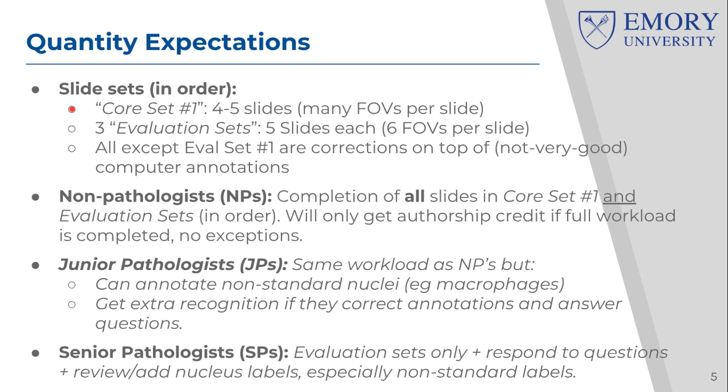The people who were with us in the previous iteration of this project know that the core set is annotated in a kind of collaborative fashion. So for the core set, you make annotations, you share your questions with the senior pathologist in the group, or other people in the group. They answer your questions, then you go back on the core set and make corrections and so on. The evaluation set is different.